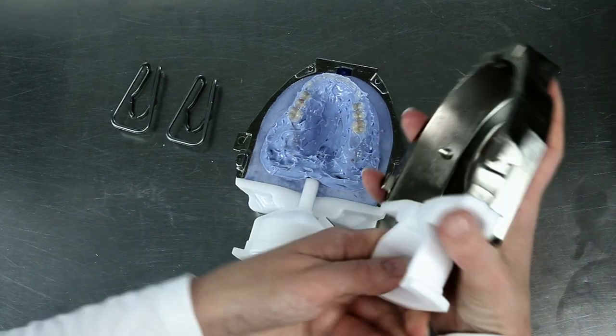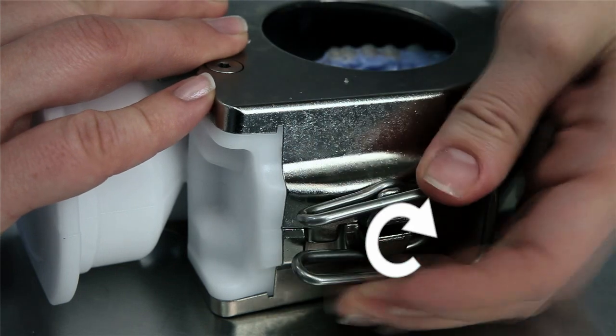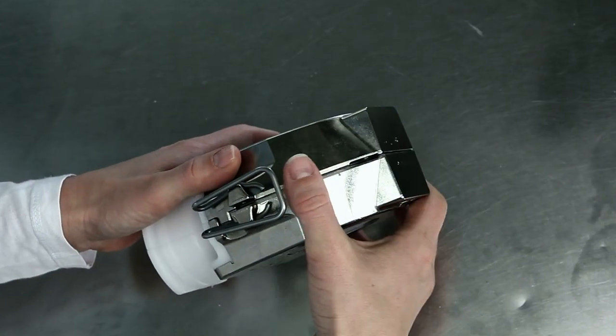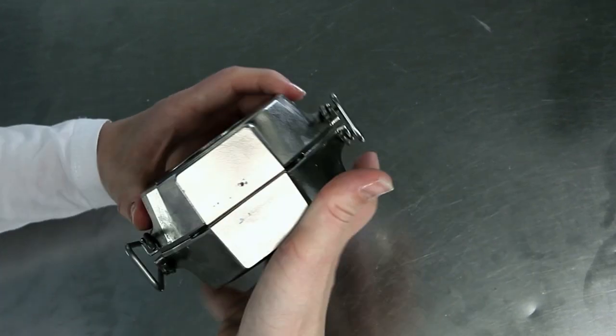Now lock the two flask halves using the locking clasps. Make sure that the flask edge is clean.